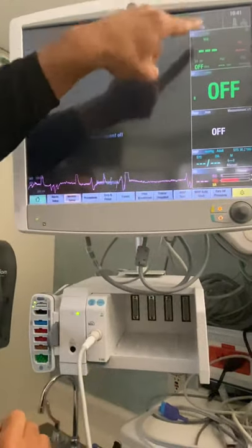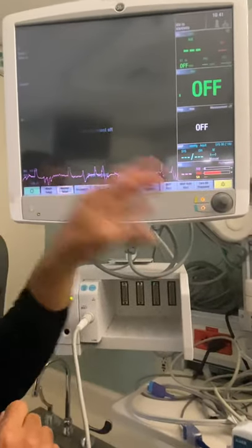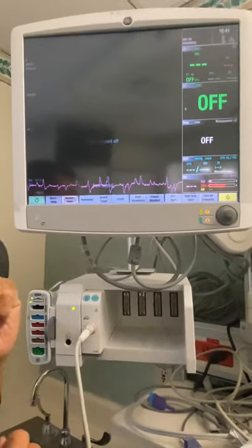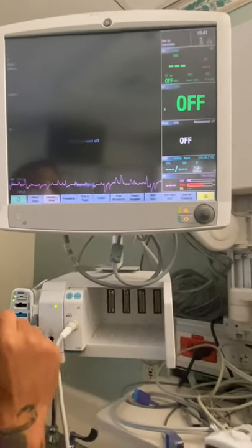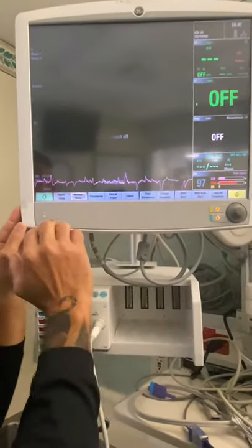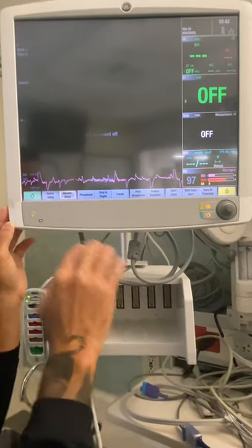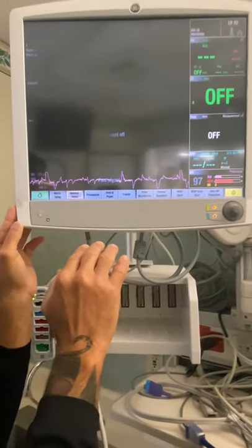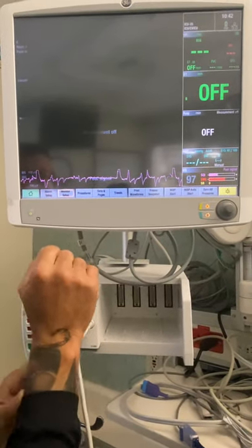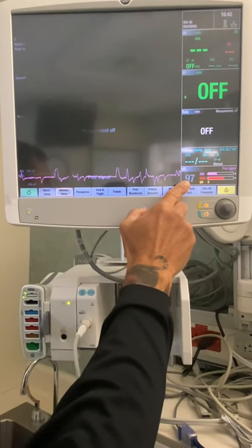If you have a lot of things populated, like a center line, a CVP, temperature, all of that, you might not have enough room. You might have to take one of the other ones out for this to show up. If there's a lot of activity, you are not gonna see those waveforms. This is only for paralyzed patients, okay? Not for any patient that is not on a paralytic, only for paralyzed patients. And this number right here is your measurement.